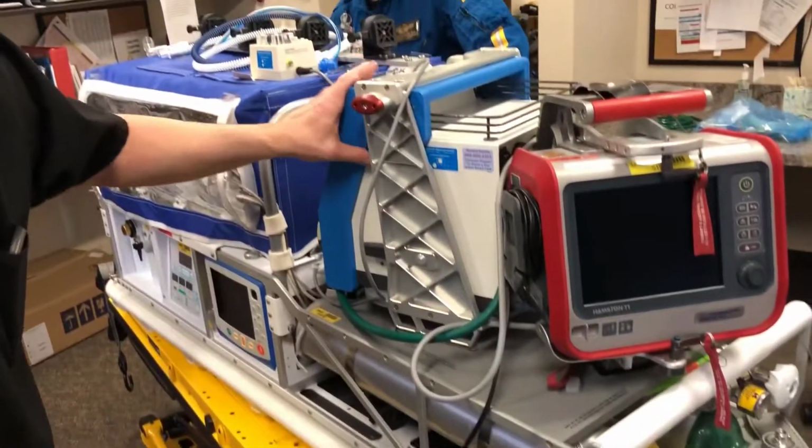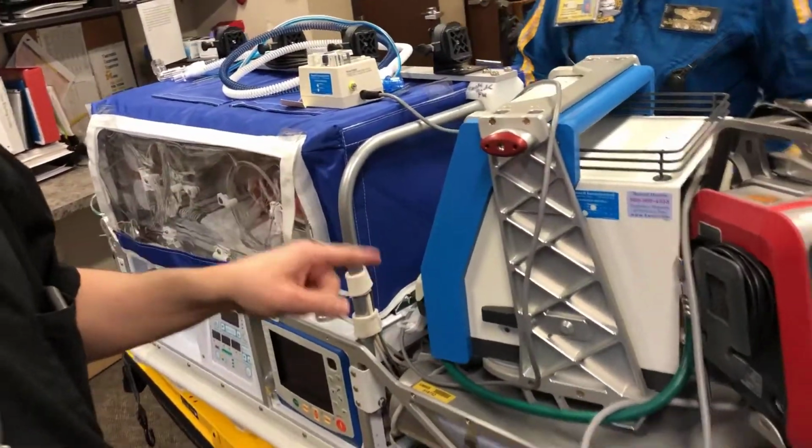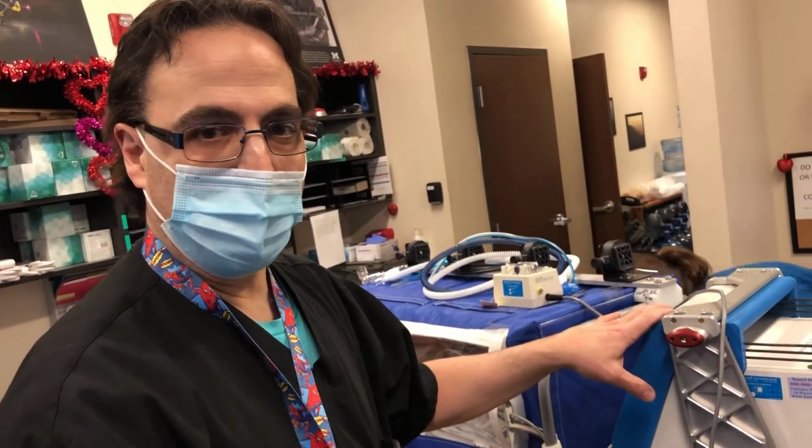And then make sure it's locked again securely. You should be good to go. Remember, you need to be plugged into AC to get the jet to turn on. Once the jet is turned on, you can disconnect from AC and the battery will take over.